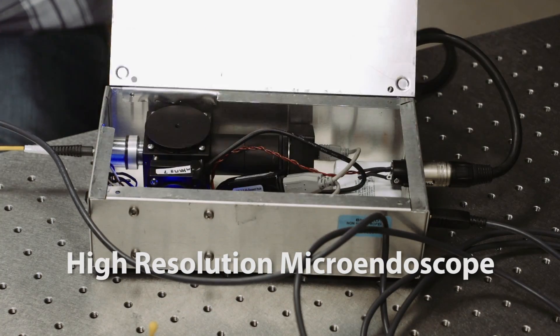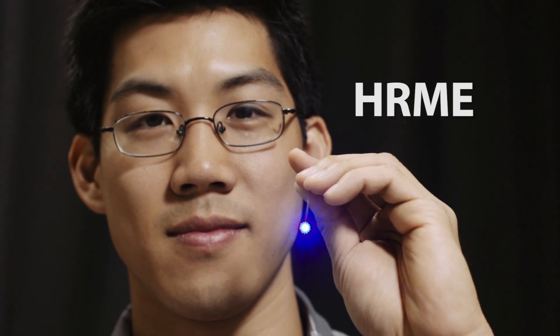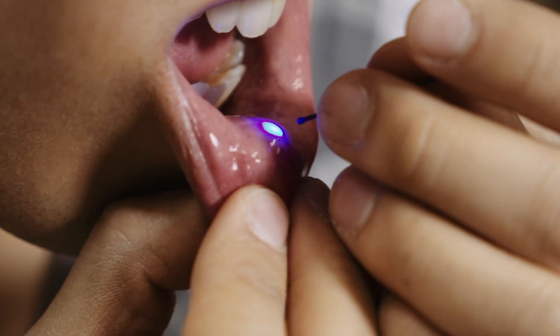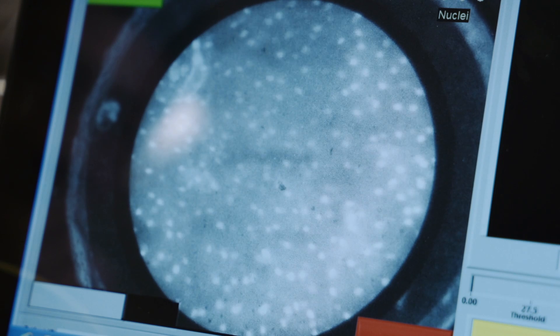This device is called the high-resolution microendoscope, or HRME for short. It consists of a fiber optic bundle that's attached to a microscope system that's all enclosed in this box right here. Without having to take any tissue out from the patient itself, you can see what the cellular morphology is. Without having to do anything else, you basically just have to place the probe onto the tissue. A clinician can make the diagnosis right at the bedside.